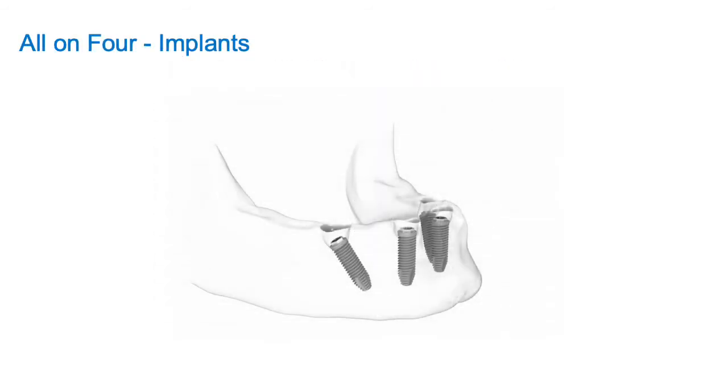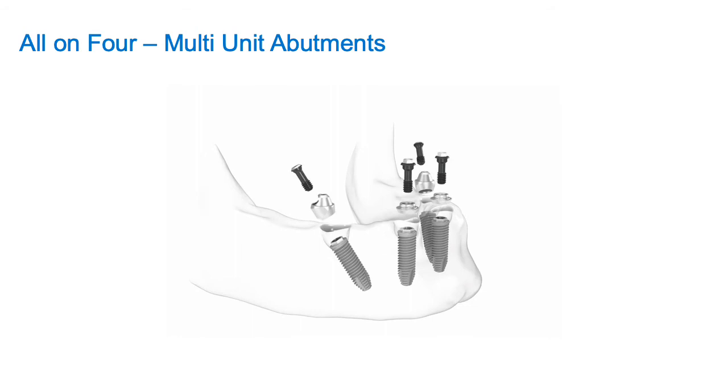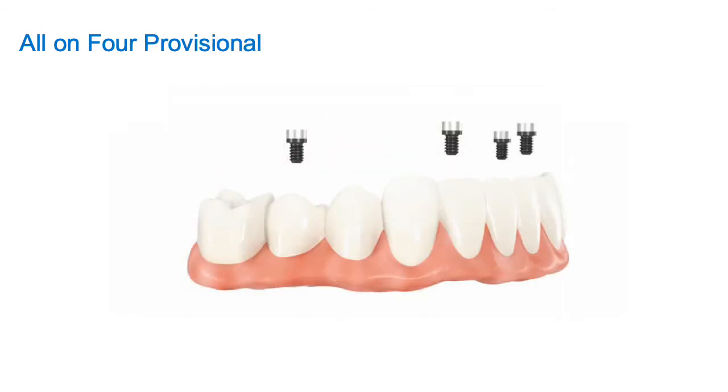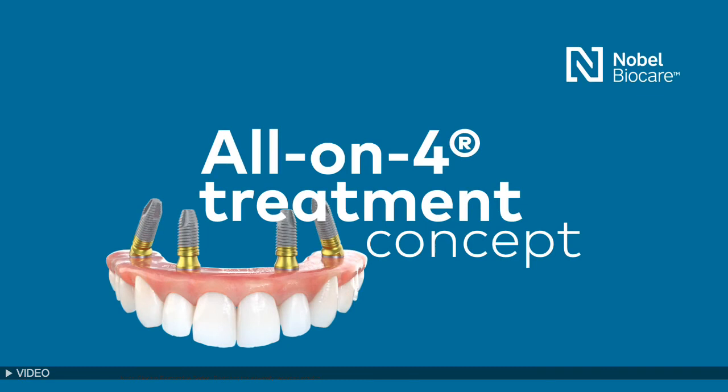When your teeth go away, your muscles are no longer functional the way that they should function. I'm running way behind, and I'm going to probably skip through a lot of this. You're having higher prevalence of myalgias, TMD, overclosure. So there's a lot of consequences with tooth loss. So we really want to restore function as well as overall health. When abutment level, you all are restoring from the abutment level up in these fixed full arch cases. Everything is from on top of here, okay?